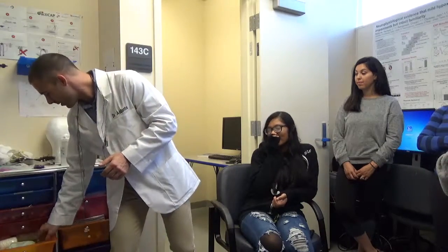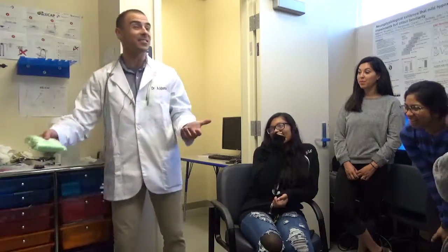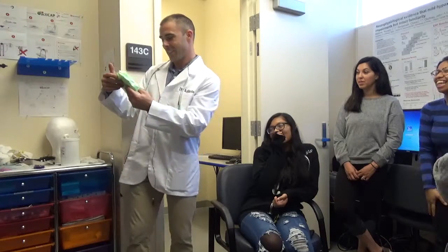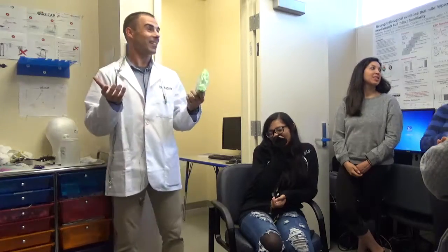I used to actually use these sanitizing electrode swabs, because that's how I was trained. But the wonderful ladies who are in our lab now brought me to see the light, and made me realize that these things exist in the world, something called cleansing facial wipes for makeup. Right? Gentlemen, did you know that these existed? I didn't. For what? Yeah. So I never knew that.